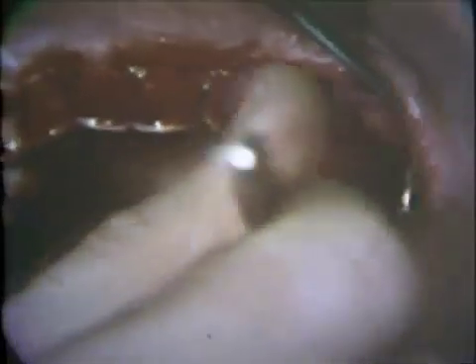After polishing has been completed, a disclosing solution is applied to the teeth. This will reveal any residual plaque and surface stainable areas of decalcification. The solution is applied to the mandibular teeth first to avoid dilution with saliva, then it is applied to the maxillary teeth. After the patient has rinsed his mouth with water, it is evident that the root surfaces have absorbed or retained some stain from the disclosing solution, indicating the need for additional polishing.